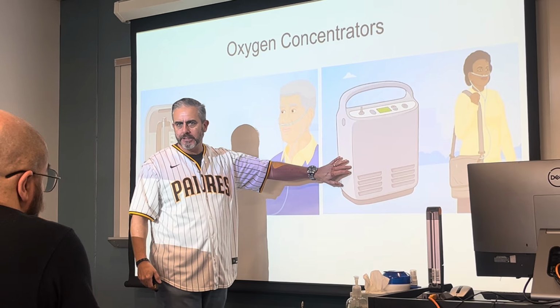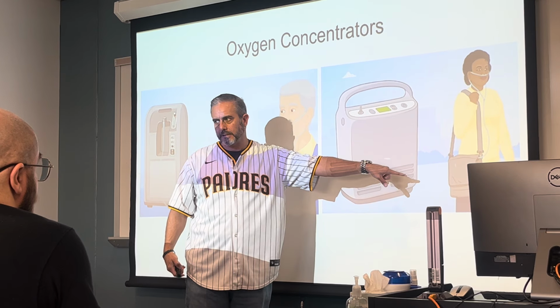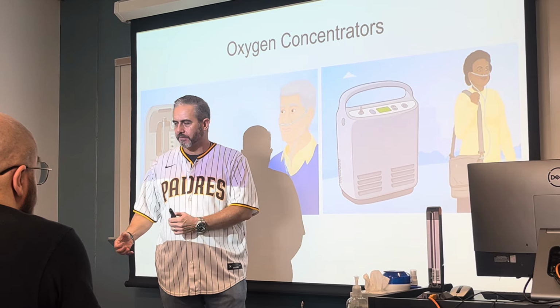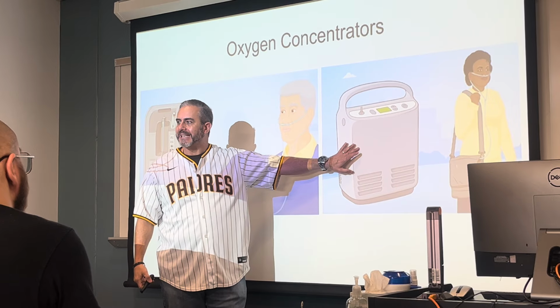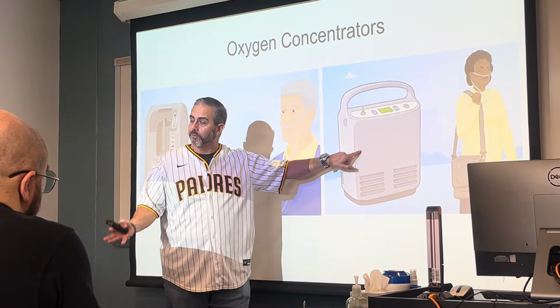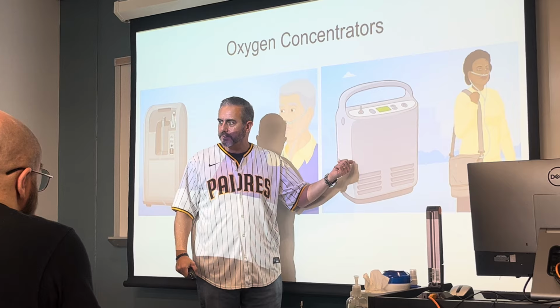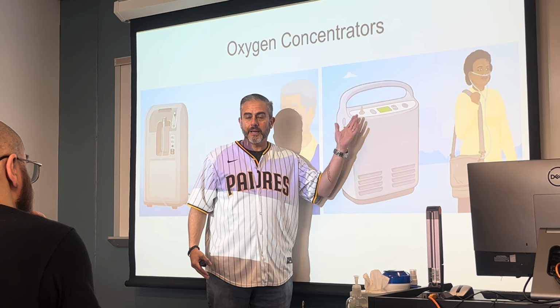Something else that can be used is a portable concentrator. So this is a portable one. You can see, again, patient kind of sling it over their shoulder. Not quite as heavy as trying to lug an oxygen tank around. Now oxygen tanks, of course, will come in wheeled carts to make it easier to transport, but this will make its own oxygen. So if the patient's gonna go out for the day or overnight or for the weekend, and they're not gonna be able to pack this, they can bring a portable oxygen concentrator. Again, it's gonna pull in, make its own O2, and provide it to the patient.